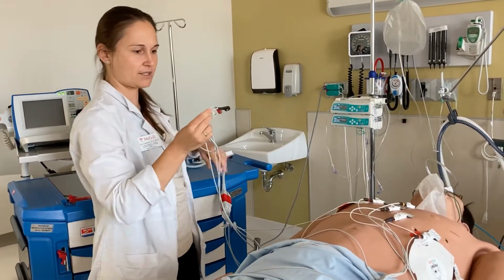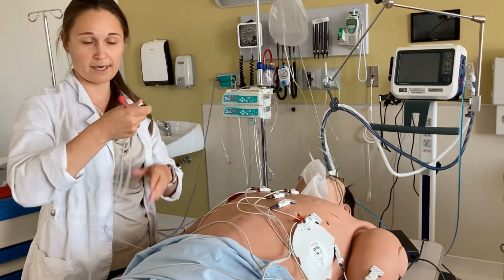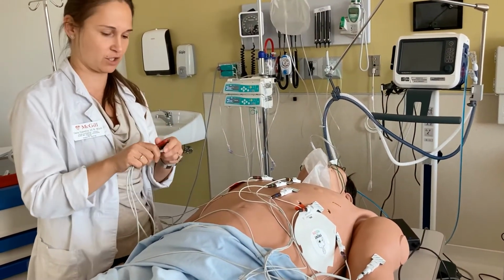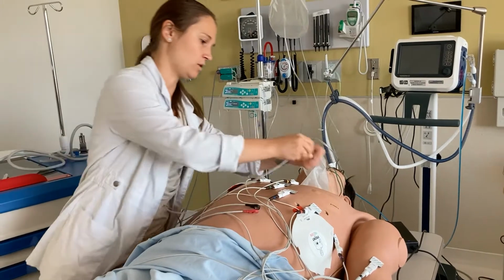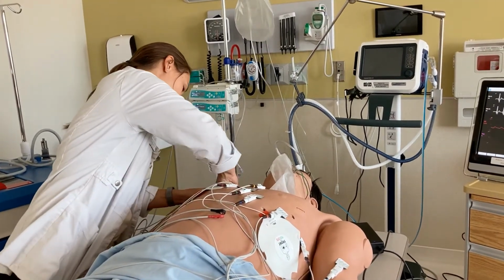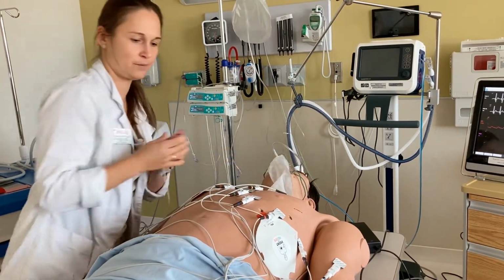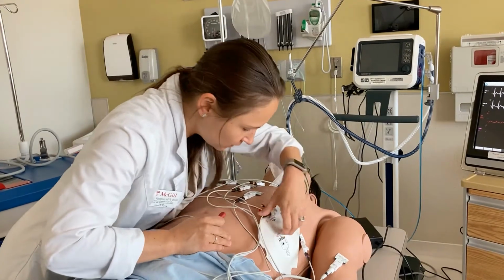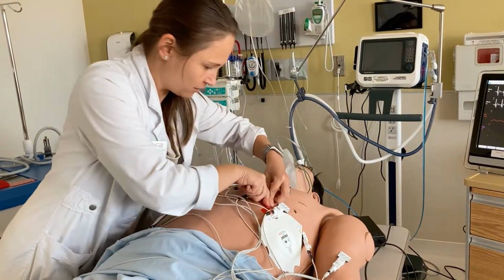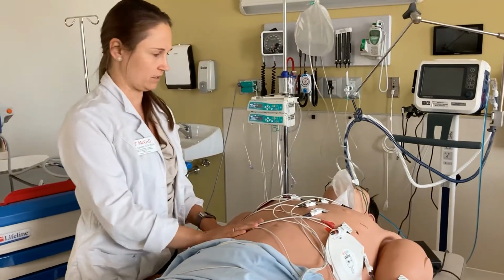Okay, I've got my leads connected, and I will place them on my patient, and I will tell you why I need my defibrillator to see the patient's EKG. So white goes to the right. Oh, yeah, this is the right. Okay. And then we have black, smoke over fire. And I will make sure that this is all nice and tight. So now the patient's chest looks really busy.